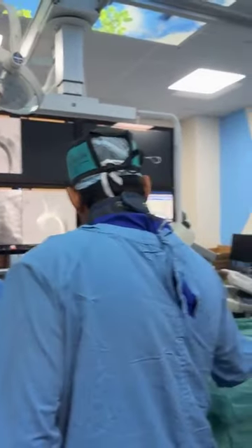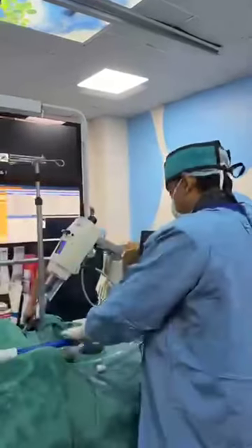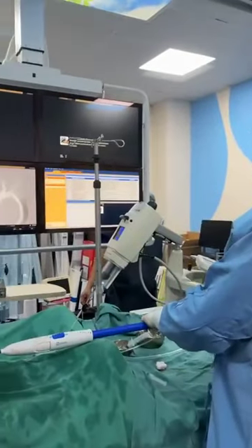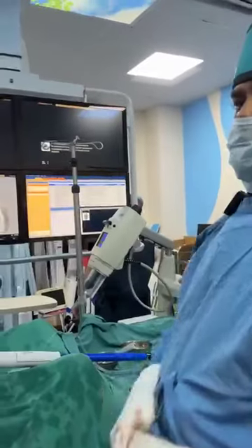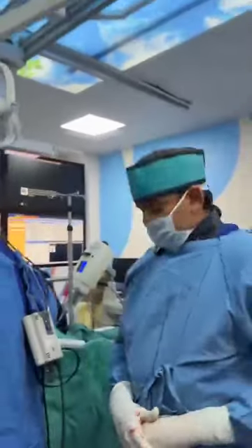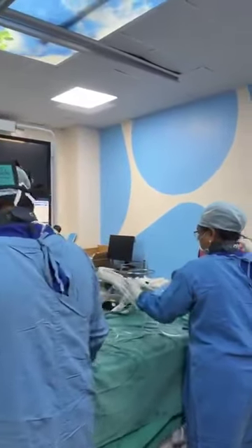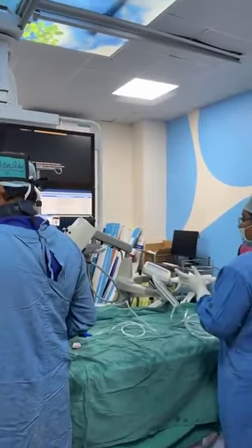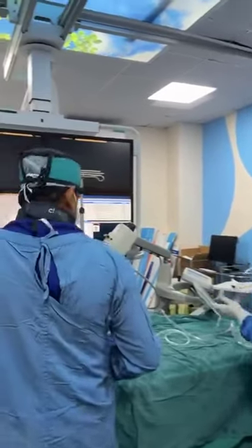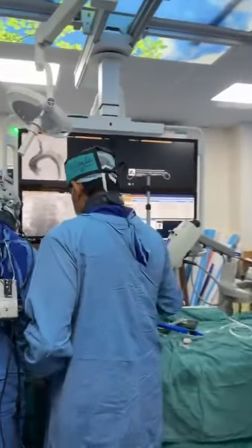So is it done, right? Shall we remove? I will remove if you have a clamp ready. I'll just keep the wire. Surya, come. Wait. No, wire is there. No, if this comes out, it will bleed. Okay, then you can just take the clamp. This is the first thing. Right, give me a clamp, suction, swab. 60 ready?